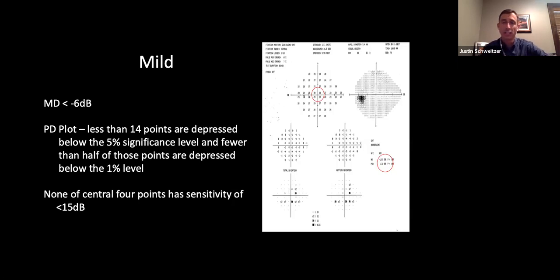And so if you look at the visual field over there, I circled in red all 3 things that come into play. Over here is where you find your mean deviation and your pattern standard deviation. So this area corresponds with these 2 right here. And then the central points, you would look right here to look at those decibel levels, looking at the sensitivity on there.